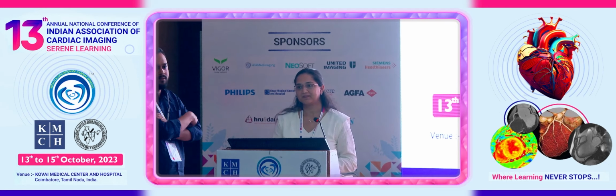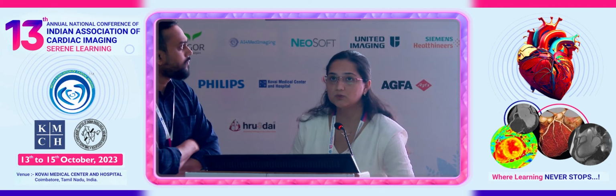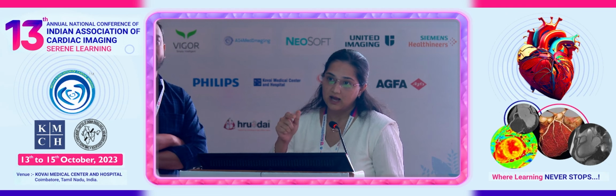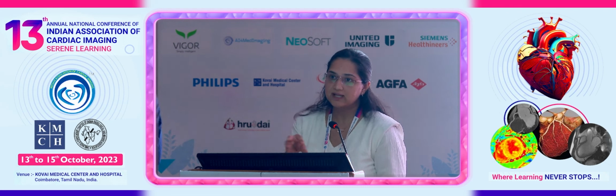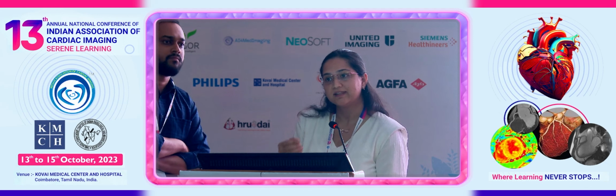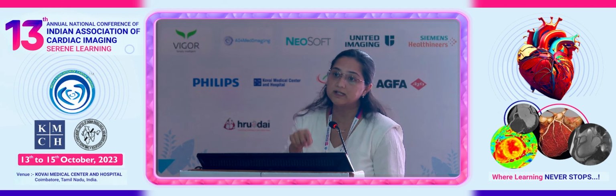They didn't have a flow on the 2D echo. No, ma'am, it didn't have a flow. Surprisingly, that is also a reason why it could have been thrombosed. But we couldn't confirm the thrombosis until after doing the CT and the coronary angio. Some thrombosis might have been there, but on MRI we couldn't appreciate that thrombus. That is why we thought that if we had done CT, we could have exactly quantified how much thrombosis is there. Because on echo, it appeared echogenic. Otherwise, it should have appeared cystic with flow.